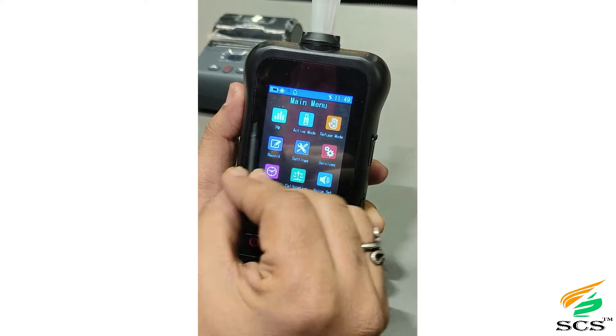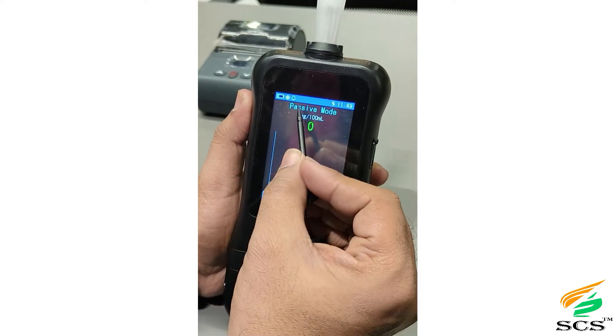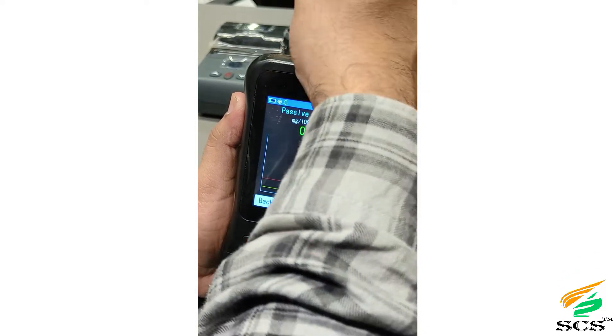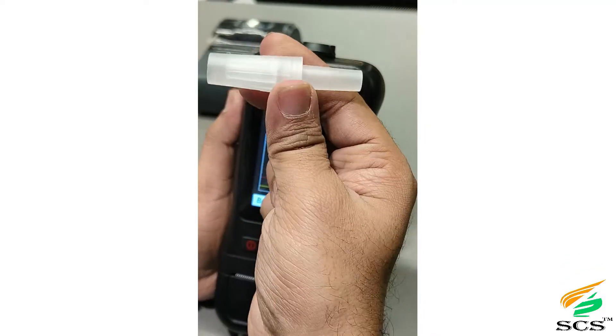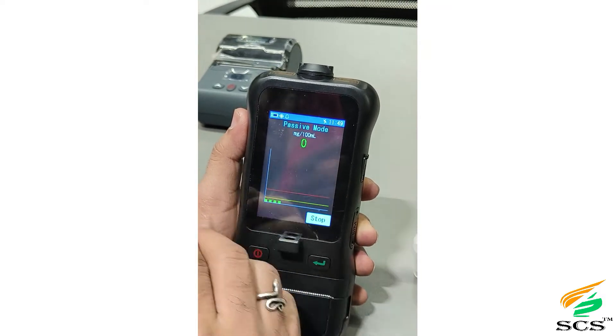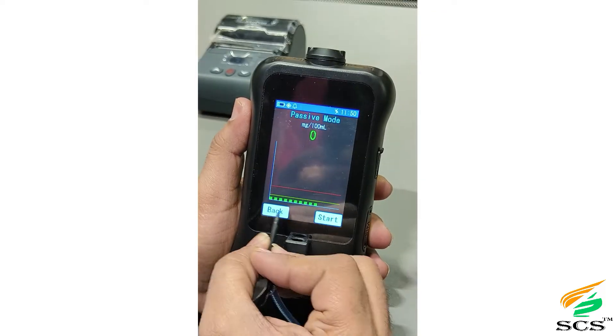This is the main menu. This is the passive mode — in passive mode, the user can easily take a test without a mouthpiece. Click on Start; the device begins testing, the test completes, then click Back.